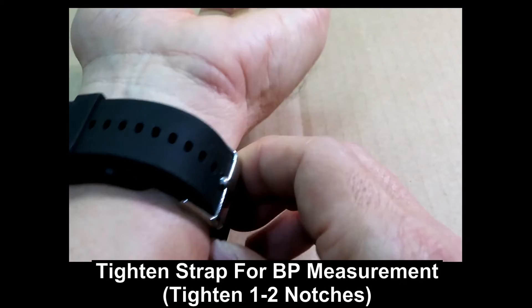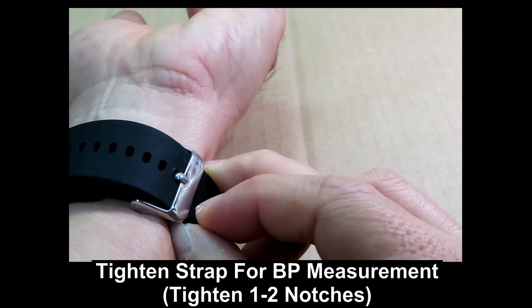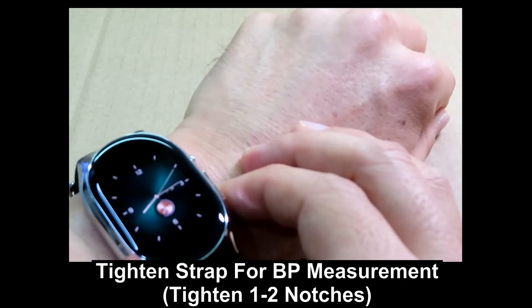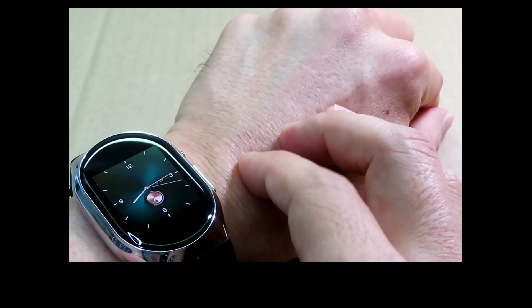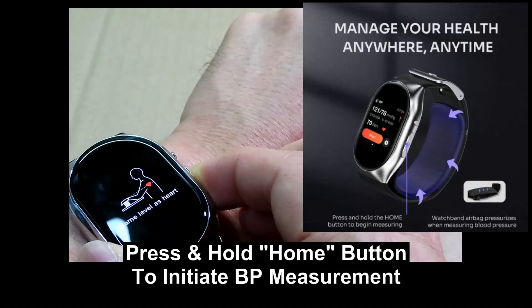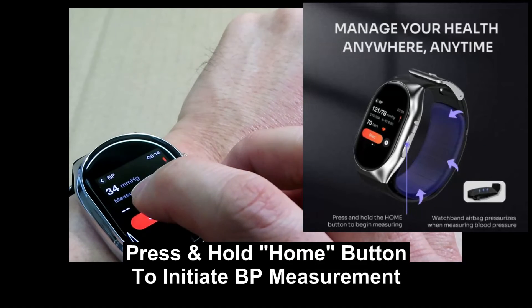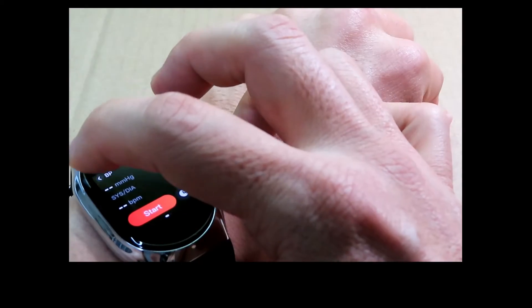For BP measurement, you need to tighten about one or two notches tighter from what you are currently wearing in order to take the blood pressure. There's also a shortcut to take blood pressure by pressing and holding the home button — it will go straight into BP taking. It will stop if you haven't tightened the strap on your hand.